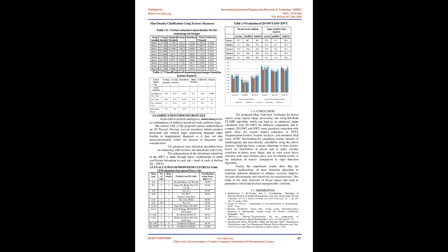1.6. Conclusion. The proposed mass detection technique for breast cancer using digital image processing and the threshold CLAHE algorithm can lead to an enhanced image calculated with 2D DWT for different components, and to compare 2D DWT and HWT using geometric extraction with Gabor filter for texture feature extraction in SFTA, segmentation feature texture analysis, and automatic ROI using OTSU thresholding for calculating texture measure of mammograms, and mass density calculation using the above features.